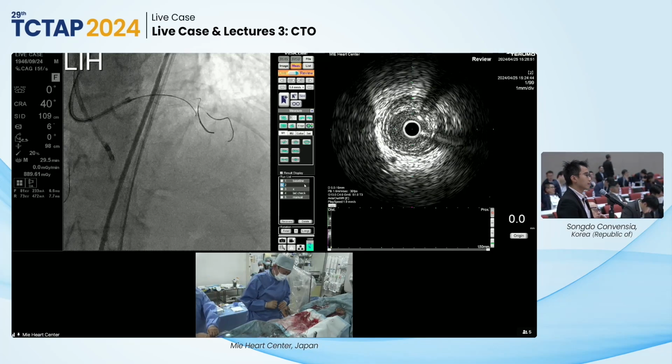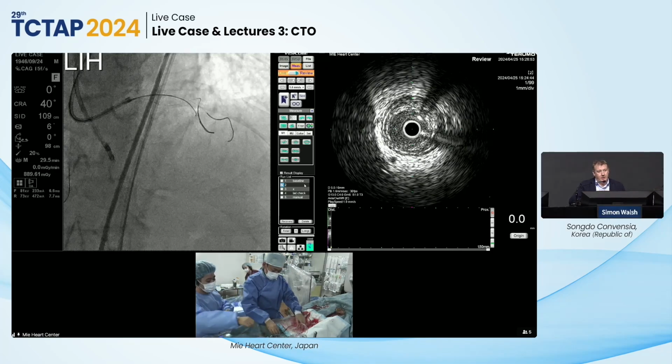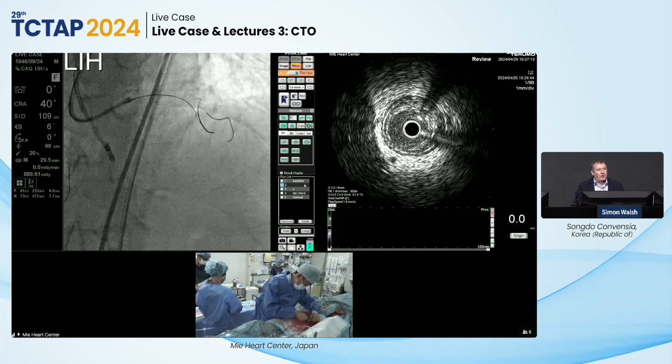Yeah, I think if you've got the microcatheter close to the wire tip, you've got much better control and manipulation. The further the wire tip gets away from the exit point of the dual lumen catheter, the less supportive an environment it becomes, and the less you're able to torque control. So we're probably at a point here where it's getting close to the trade-off of a microcatheter being a little more helpful just to get to the next point of the procedure.